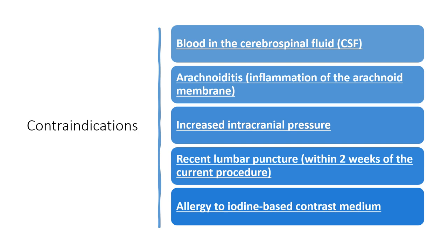Contraindications. Blood in the cerebral spinal fluid, CSF for short. The presence of blood in the cerebral spinal fluid indicates probable irritation within the spinal canal, which can be aggravated by the contrast medium. Arachnoiditis, inflammation of the arachnoid membrane. Contrast medium may increase the severity of the inflammation.